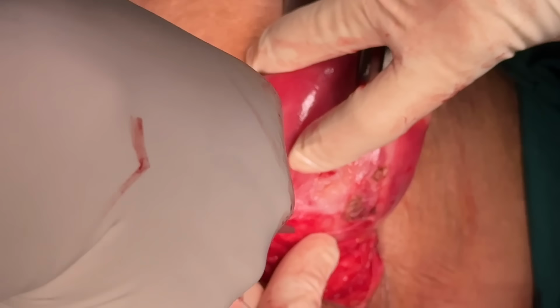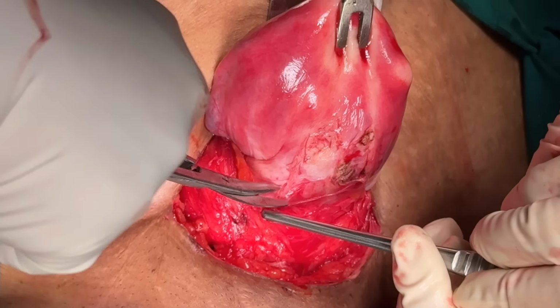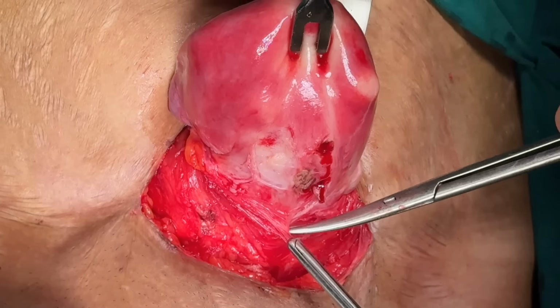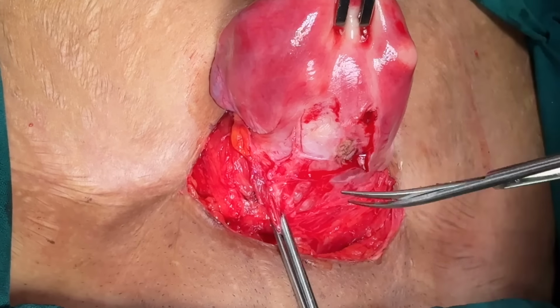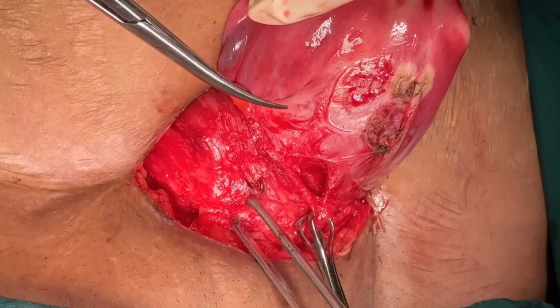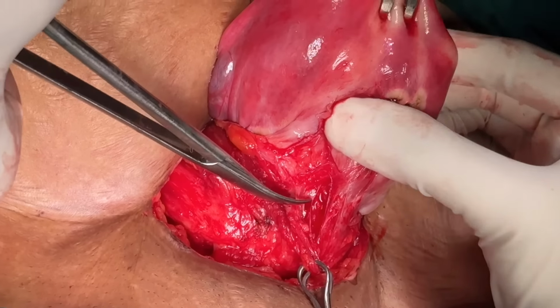The technique of this adhesiolysis is to first create the space and only then cut. Don't cut blindly because you must understand that the bladder might be there below these adhesions. Adhesiolysis should be done a bit at a time. Create space and then cut. Create space, then cut. And go on bit by bit like this. Use traction and counter traction. Traction is given by the bulldog on the fundus and counter traction is with Babcock's or a non-tooth forceps on the adherent tissues.